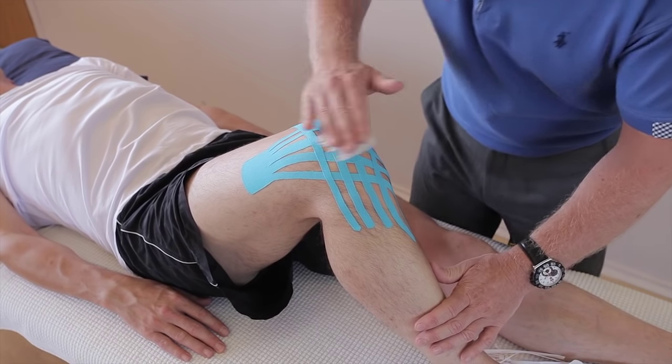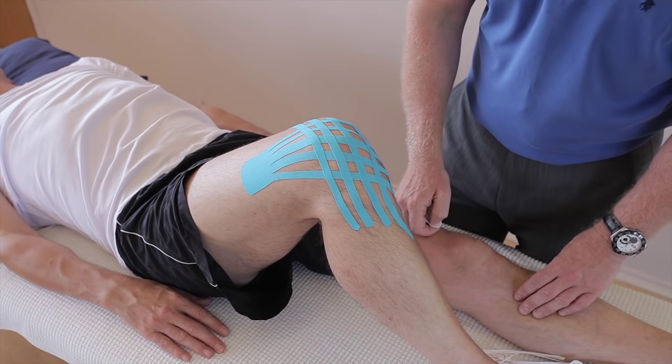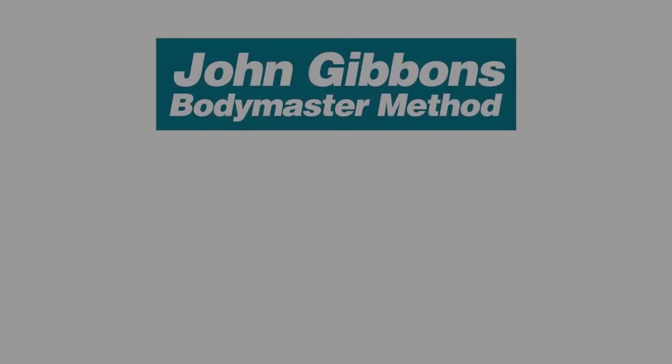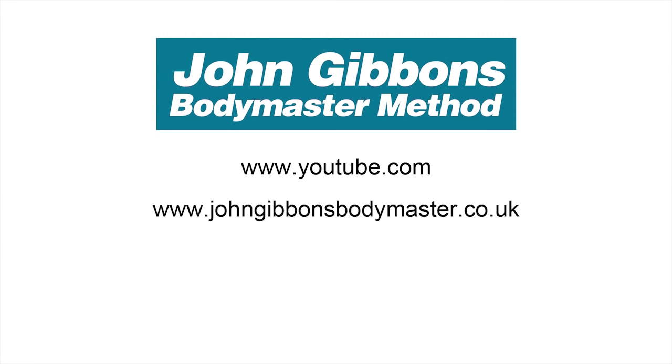And there we have kinesiology tape applied for oedema of a knee joint. More instructional videos by John Gibbons can be viewed on his YouTube channel. Visit the Bodymaster website for further information about the Bodymaster method, including courses John runs and books he's written, which are available to purchase through Amazon.